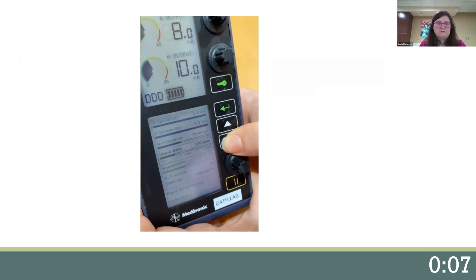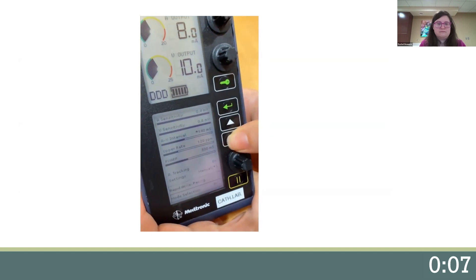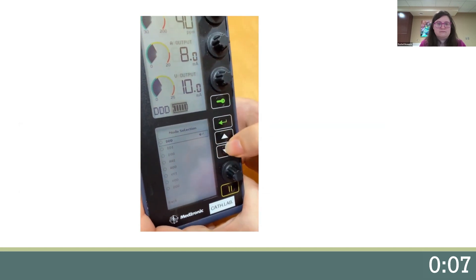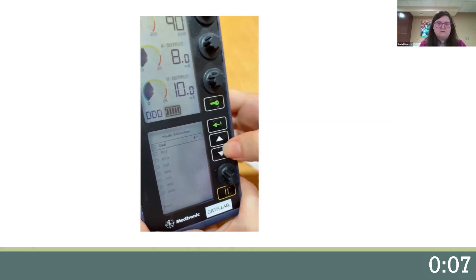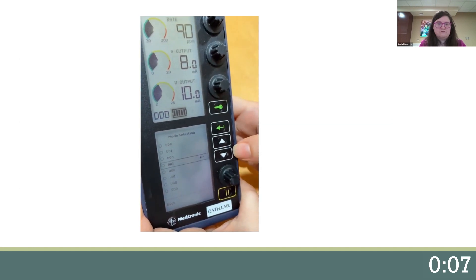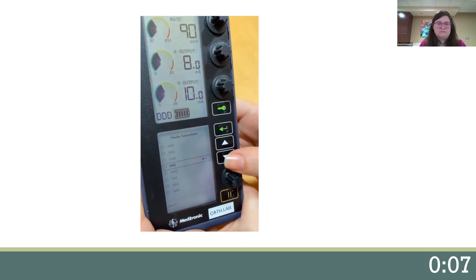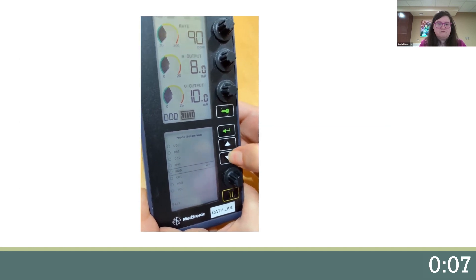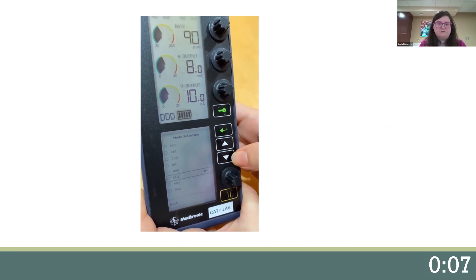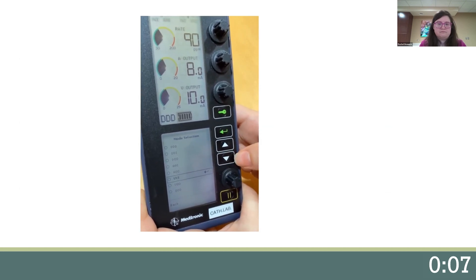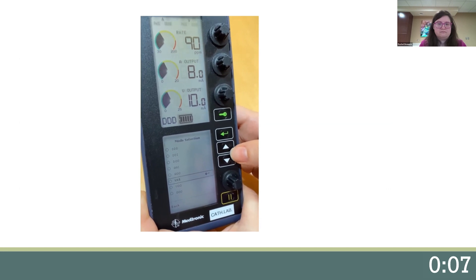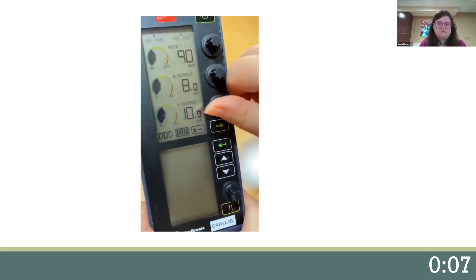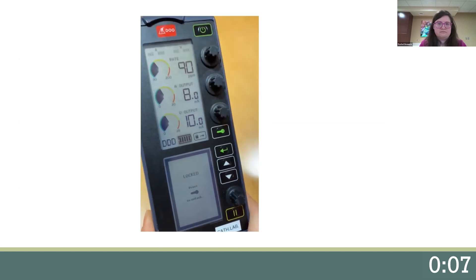The last thing is to find and set your pacing code, so go to mode selection. Here we're in DDD, doing dual pacing. If you have an intact AV node, you can choose to pace them AAI, and if there are issues with the AV node, you could choose to pace them VVI, which is ventricular pacing. Then you hit the lock so that no one can change your settings on accident.